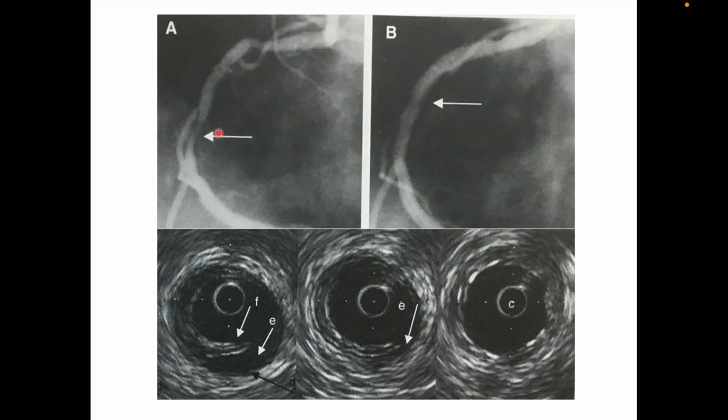This is the right coronary artery. In the mid segment, you can see a critical disease there. It was stented, but there is some haziness here at the proximal stent edge. IVUS was done. Now this is distal and then going proximally. So this is the proximal stent edge.